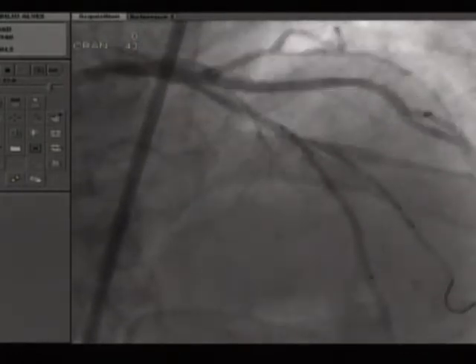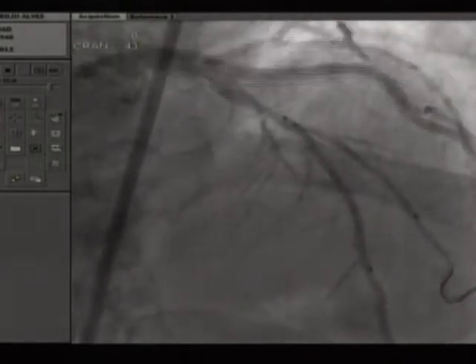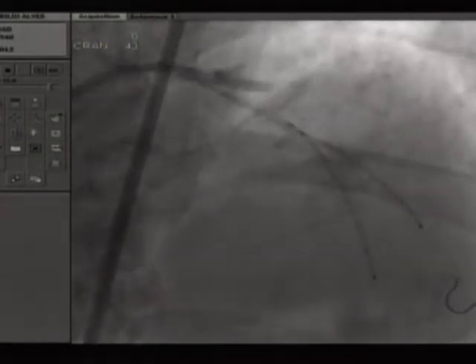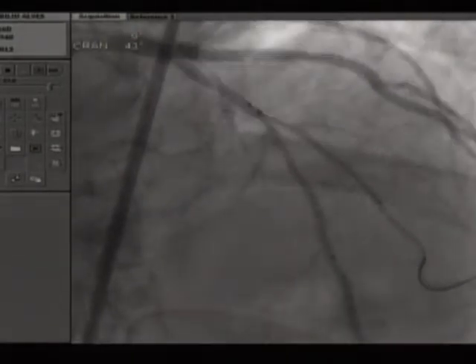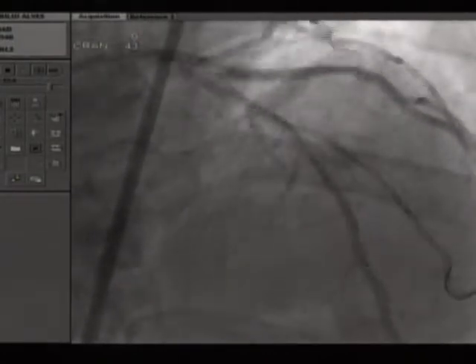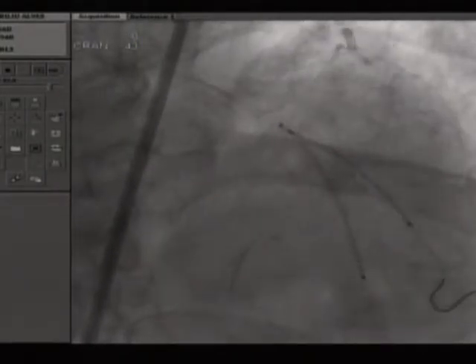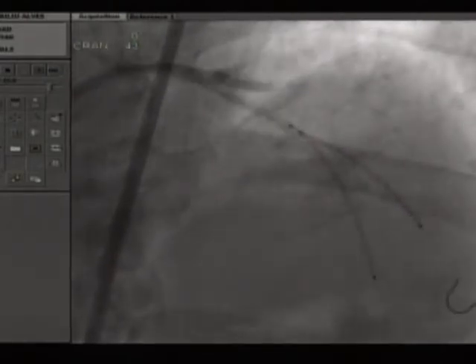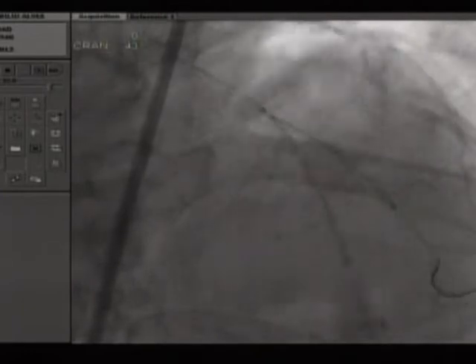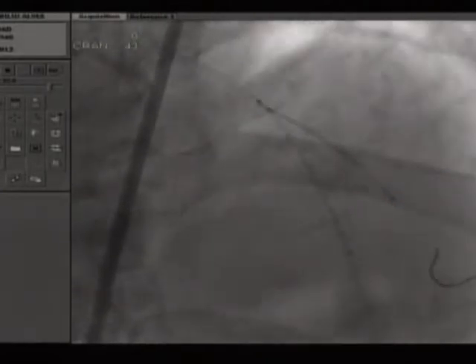What do you think, Alex, the panel, about the position of the two stents in the LAD and diagonal? It looks good from here, I think. So the steps are first to inflate the side branch, right? Yeah. And then you have the main branch already in place. So immediately after that, you inflate, and then you're going to do some crush. And I have to say that this is really a mini crush.